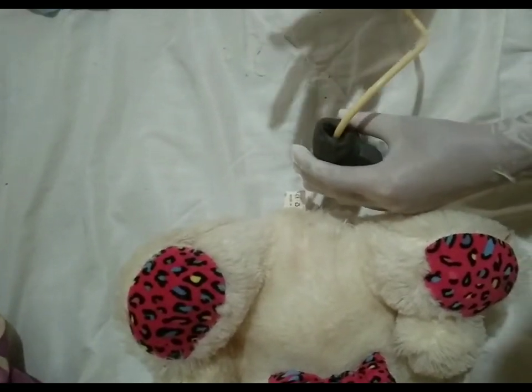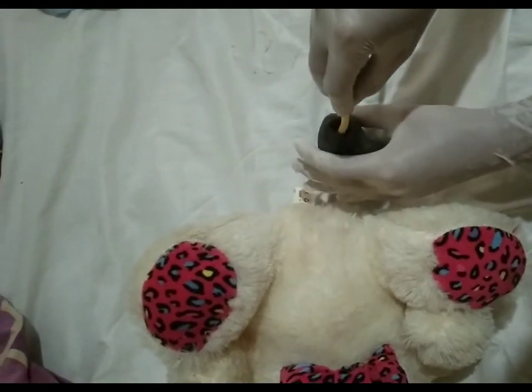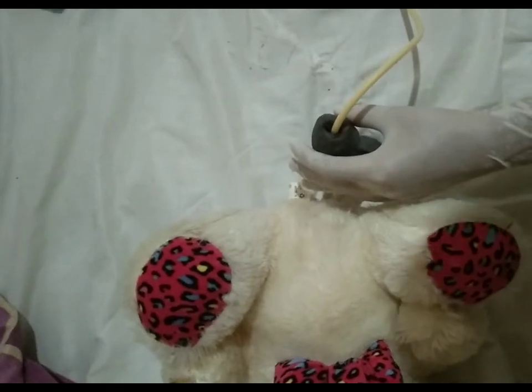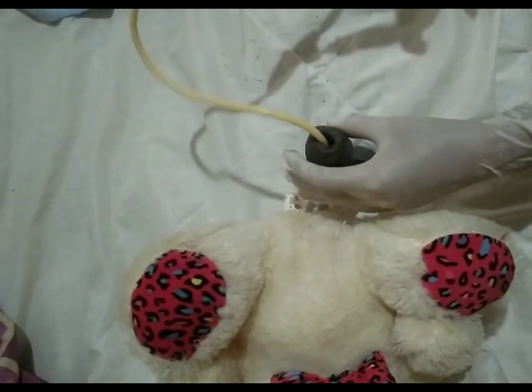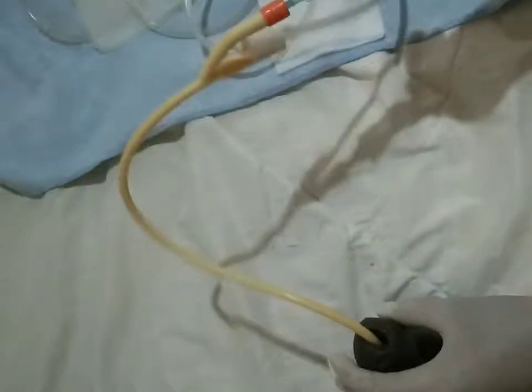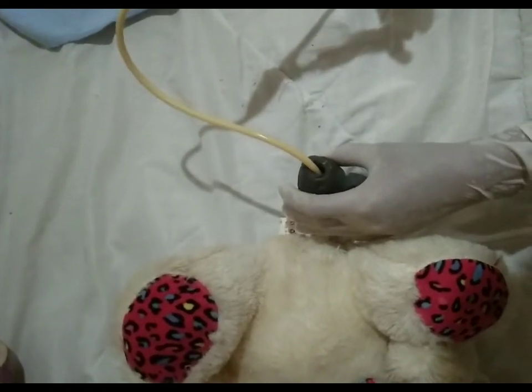So when you already see urine, just gently push it in 1 to 2 centimeters. So okay, and now we will inject the prescribed amount of water.